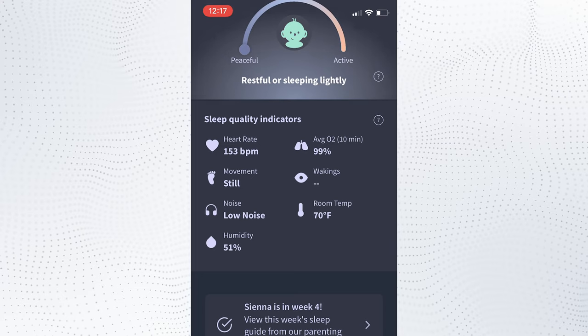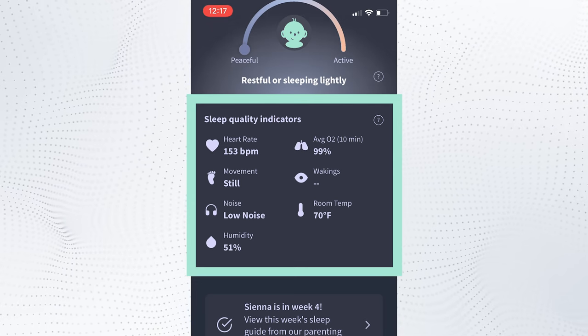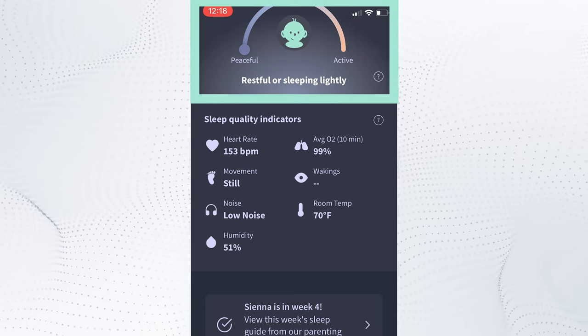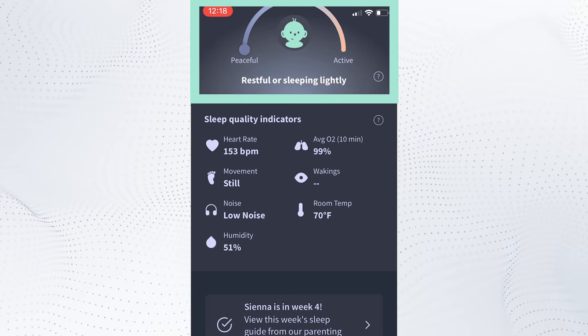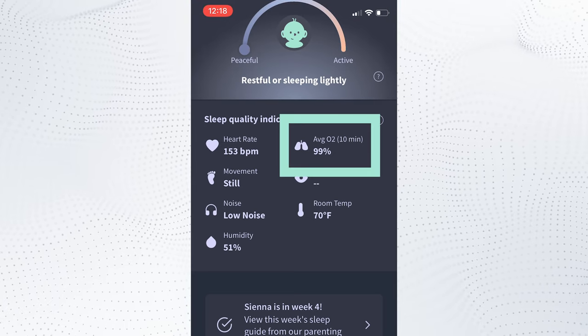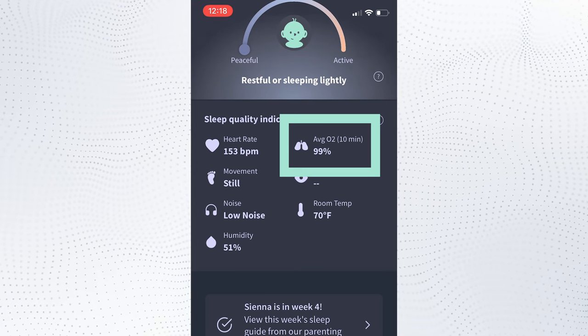When the sock is on and you open their new Dream app, you'll be able to see those indicators along with current movement patterns and how many wakings have been reported. At the top is a restfulness bar, which visually sums up everything the sock is tracking. Rather than showing you second-by-second oxygen levels, it's now only showing you a 10-minute historical average of oxygen. A common question is: if oxygen levels get low, will it still alert you as it did before with the Smart Sock?